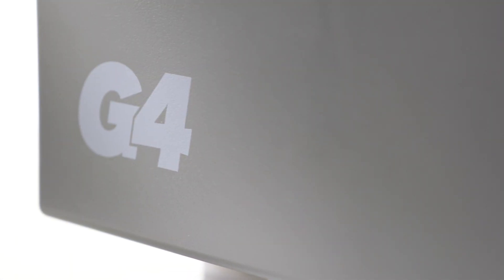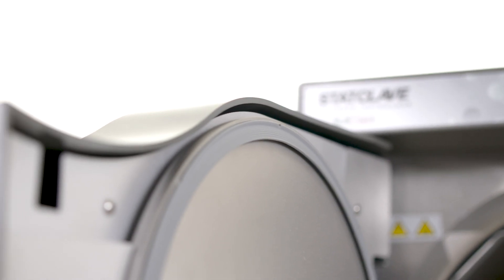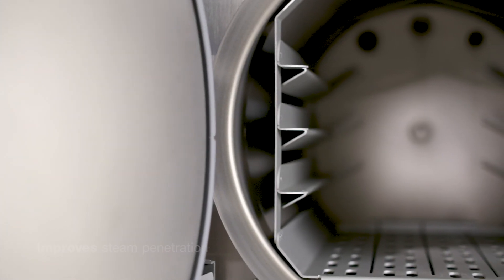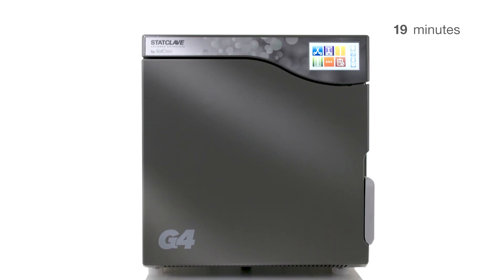The StatClave G4 Chamber Autoclave is a Class B sterilizer that addresses a dental office's need for speed, capacity and efficiency. Its cutting-edge sterilization technology incorporates both pre-sterilization vacuum to improve steam penetration and post-sterilization vacuum to improve drying. The result is sterilized and perfectly dried wrapped instrument loads in as little as 38 minutes.